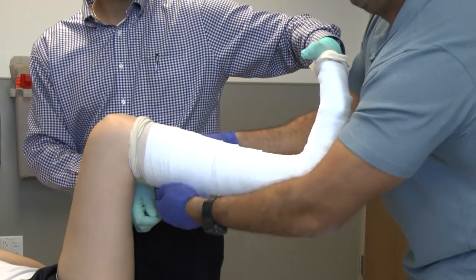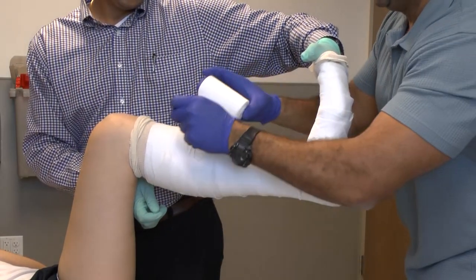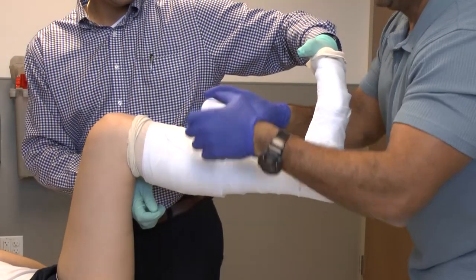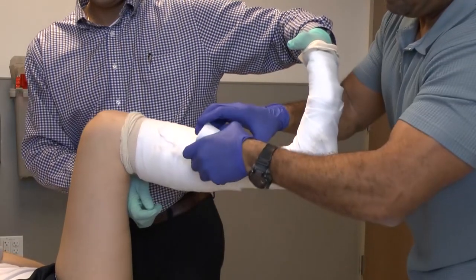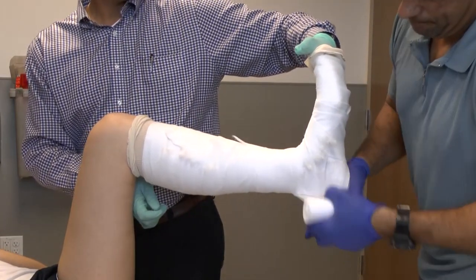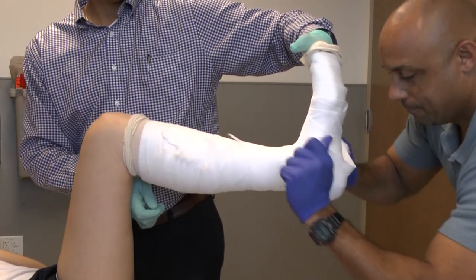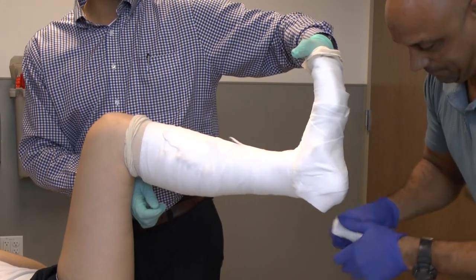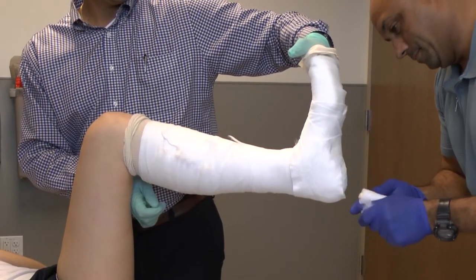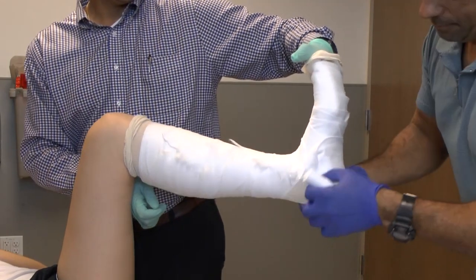Once all the cotton is in place, it is important to make sure that the heel is well padded. You'll see the applicator go all the way down and really work over the heel to make sure that the thickness at the heel prevents any blistering or skin issues. The tearing effect is applied again so that it lays down nicely.